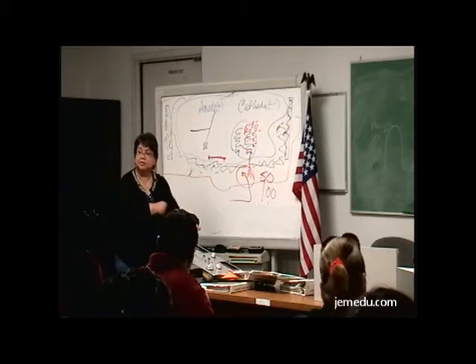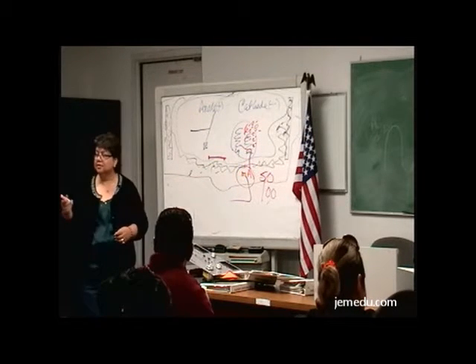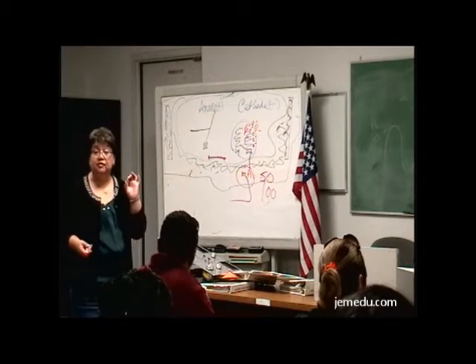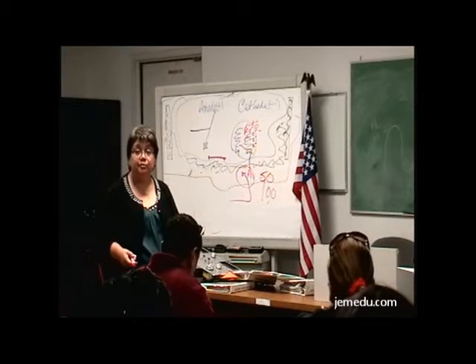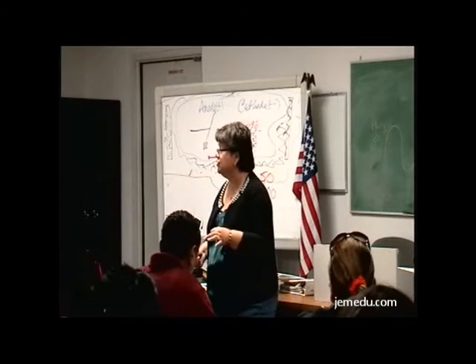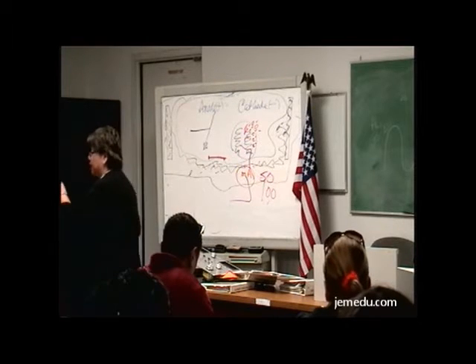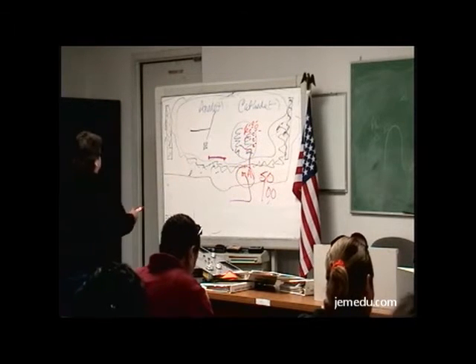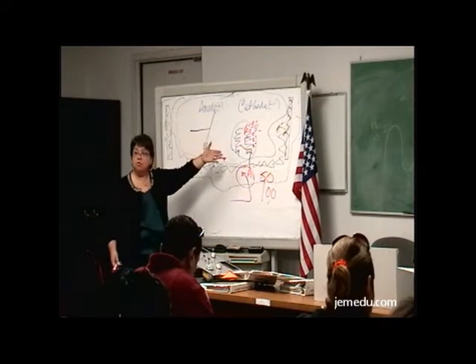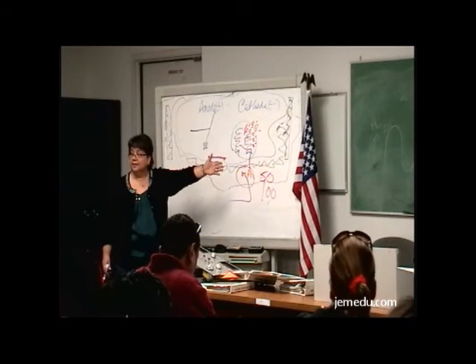Okay, because why? What is an electron? It's a negative charge particle. It's a particle and it's very, very small, correct? Going back to the atom, which is biggest, the electron or the nucleus? The nucleus is huge, thousands of times bigger than that little electron. So that little electron, because it's a particle, actually can move. So what's more likely to move, obviously? The electron. But what's happening to this tube, as we mentioned earlier, it's now more negatively charged. Negatives and positives do what? Attract.